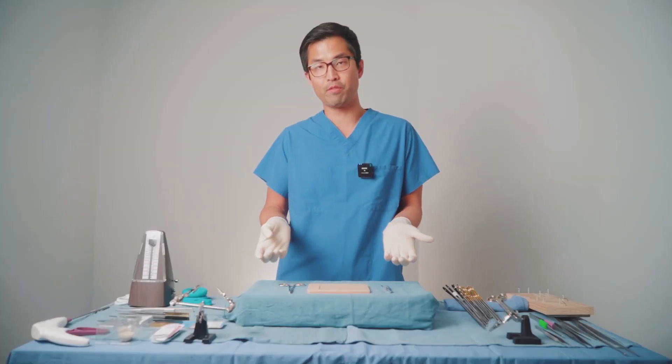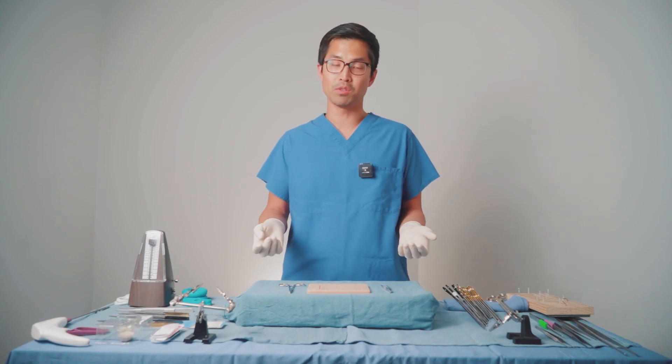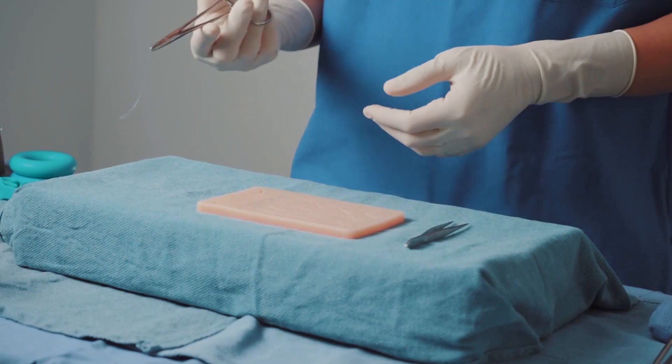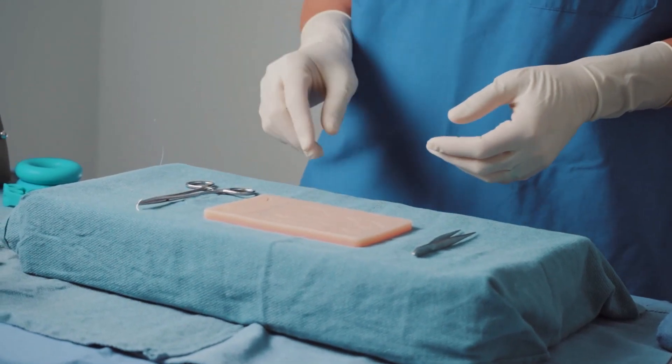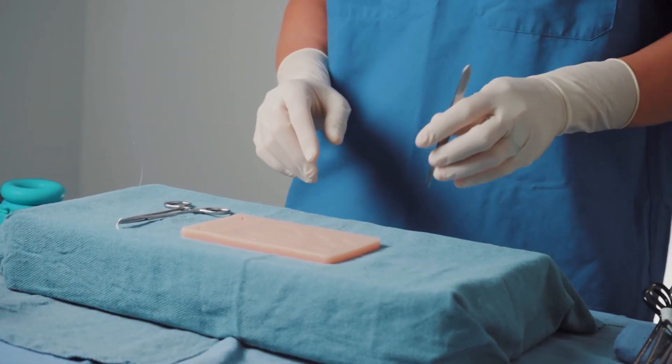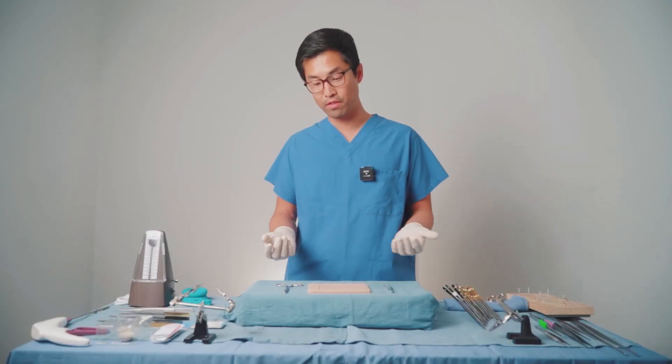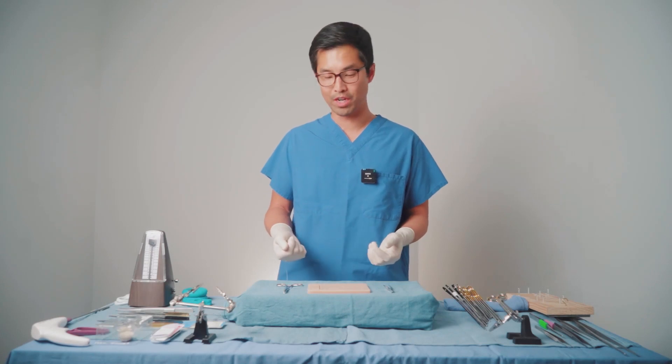Frankly, these tools discouraged me from practicing because they were uncomfortable. The needle driver is small, doesn't fit well in your hand, and it's very stiff, so every time you open and close it, it hurts your fingers. The forceps are really small and poor quality, so they're not good at picking things up. And the silicone pad just gets dirty very easily, and there's a lot of resistance when you drive needles through.